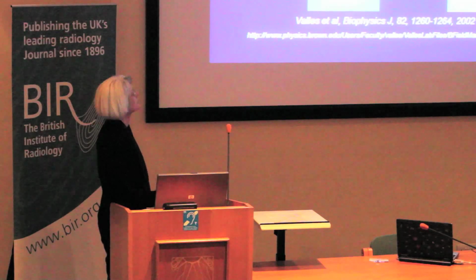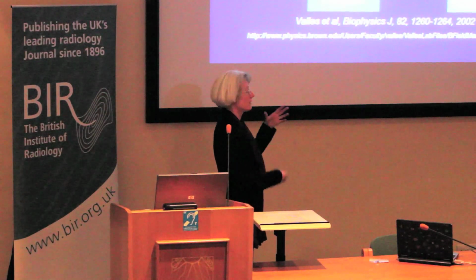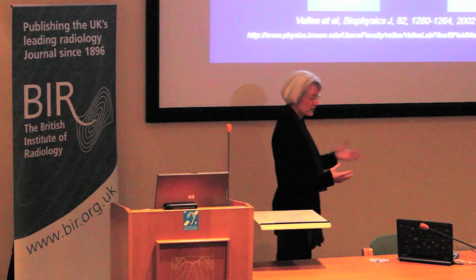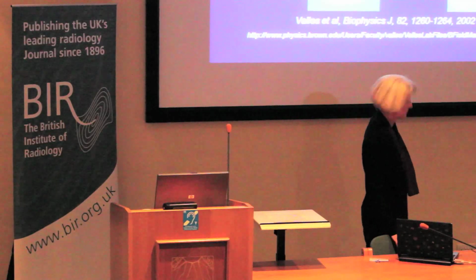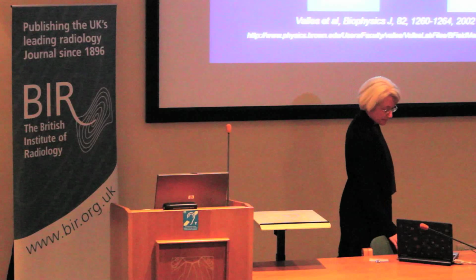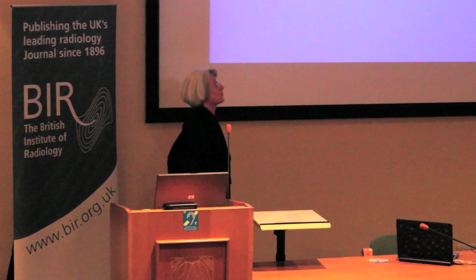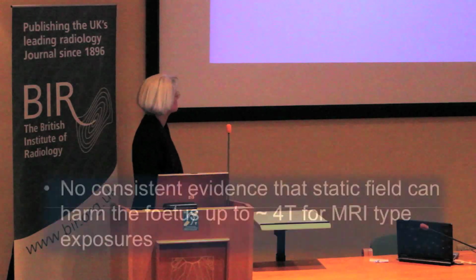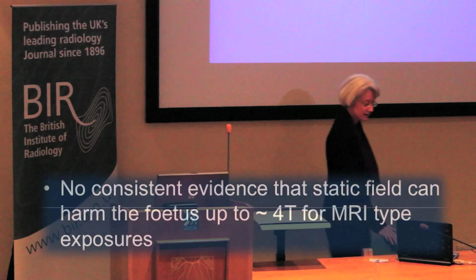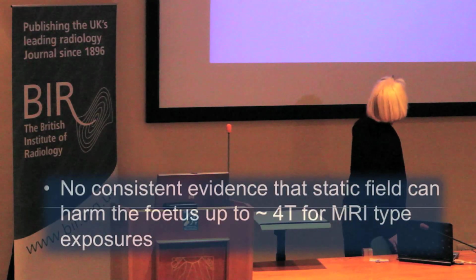However, despite this, as this animal develops, this is a frog embryo, other biological forces take over and this becomes insignificant, rather like the effects on chemical reaction rates. It becomes insignificant compared to the size of other biological forces that take over, and these frogs develop normally. So I feel very confident saying there's no consistent evidence that static fields can harm the fetus up to, say, 4T, and there's not much evidence about that either way for MR-type exposures.